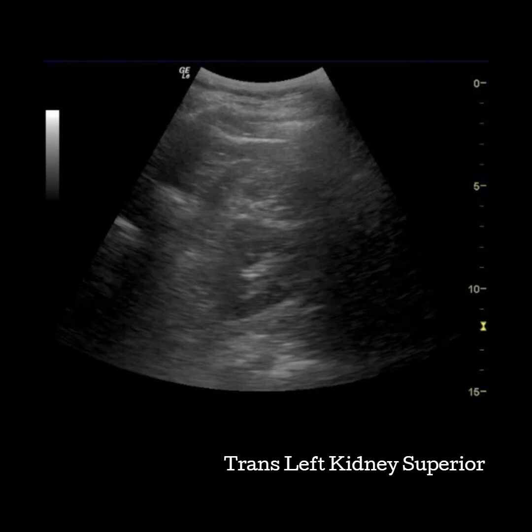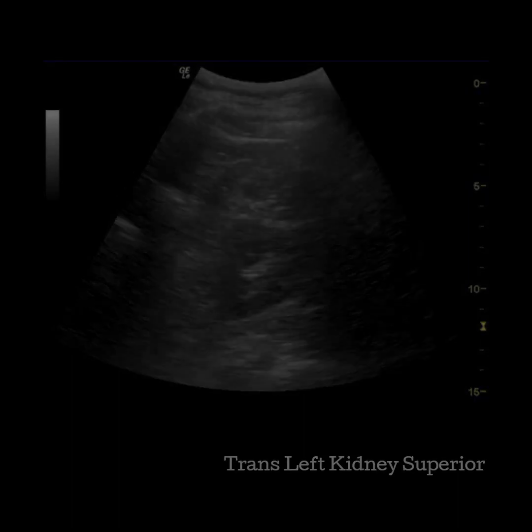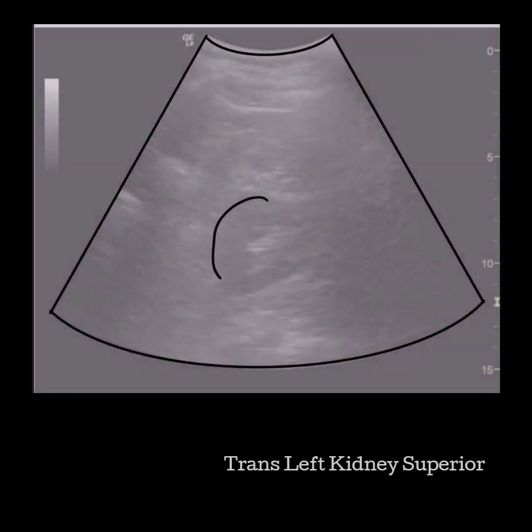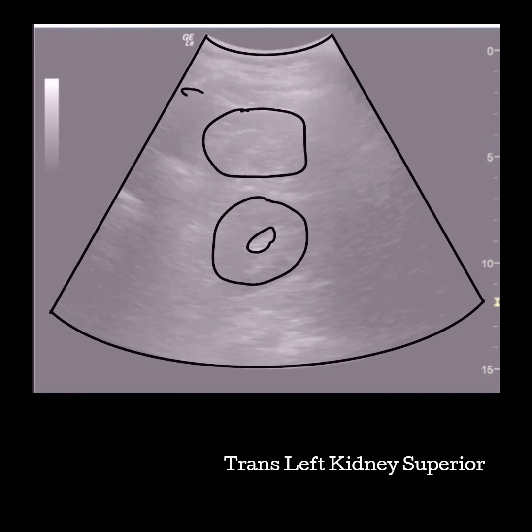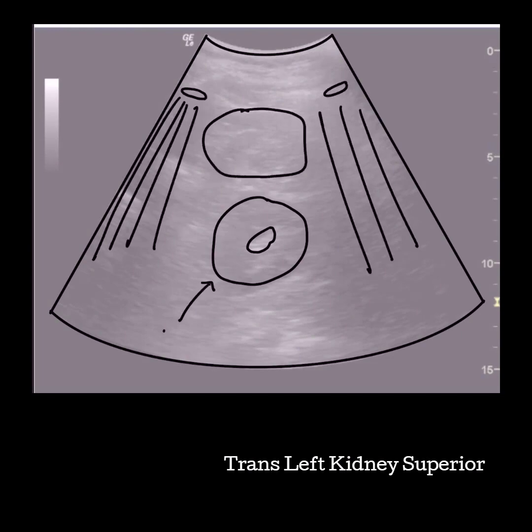Turn the transducer to round out the kidney and move it to the superior portion of the left kidney. You may need to fit the transverse kidney in between rib shadows. Go through all of your windows and remember to try to find the best spot. The spleen may be anterior to the kidney depending on your patient's anatomy or which window you use. Make sure the parenchyma is well represented with little to no sinus visible.